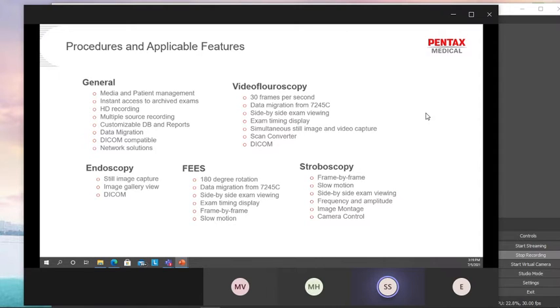There are a lot of technologies out there and everyone is saying they have something different, but they are not able to tell you the exact point at which the glottal cycle closes. They can have measurements of the glottal gaps, etc., but that will not tell you whether it is closed or not closed. So doctors have to strain their eyes to determine that.